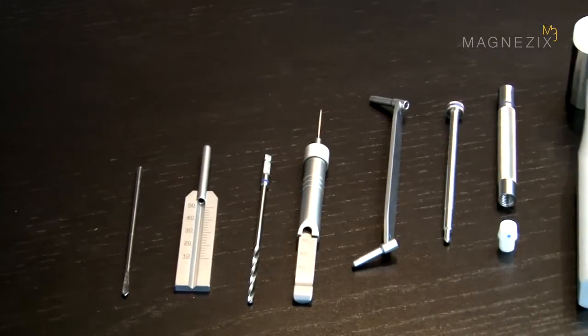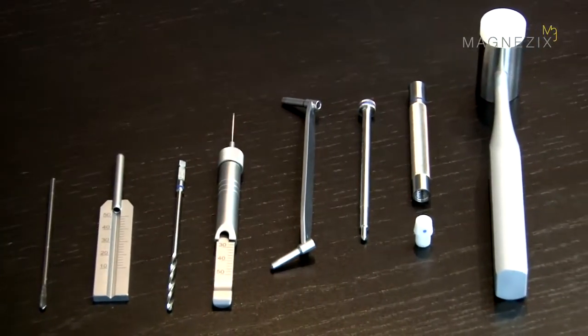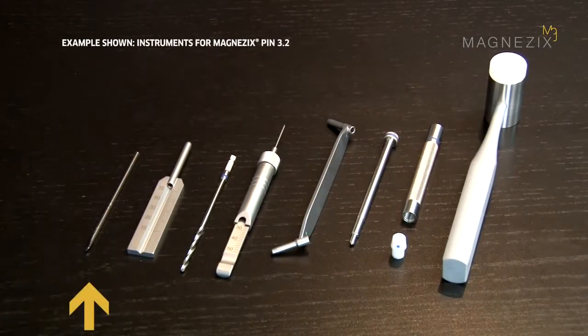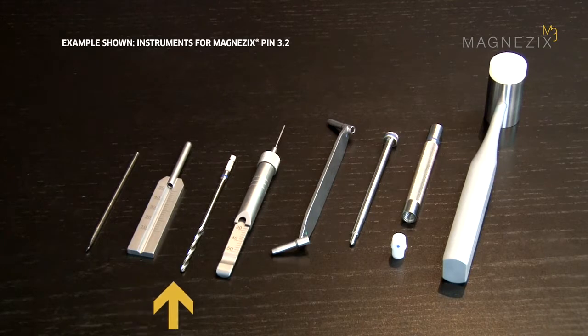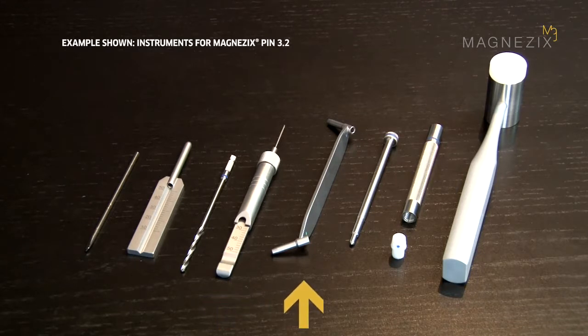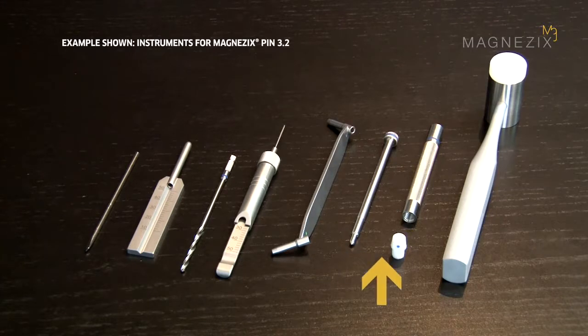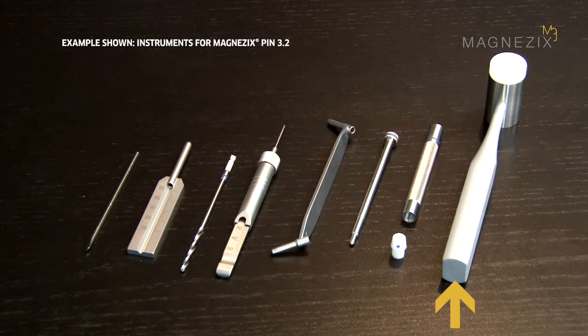You will need the following instruments to implant a Magnesix PIN 3.2: a 3.2 mm reduction wire, the measuring device, a 3.2 mm drill bit, the depth gauge, a double drill guide, the impactor with sleeve, insert and screwing tip, and the optional hammer with plastic insert.